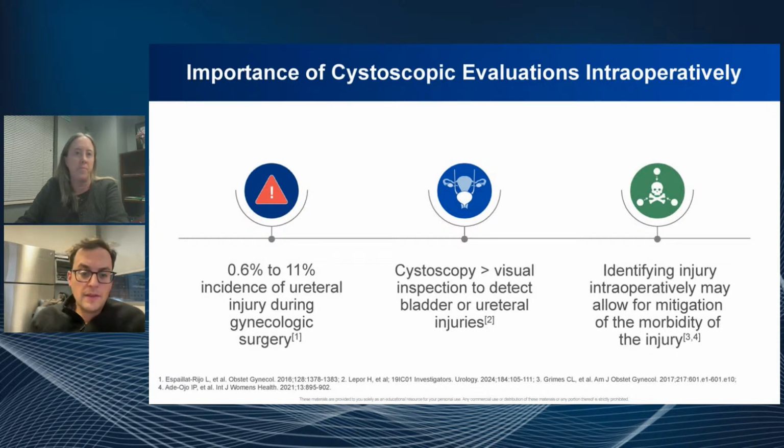Yeah, so Cara, thanks first of all, and I want to thank everyone that signed on tonight. Cystoscopy and looking for ureters is important for a lot of the surgeries that we do, and even general surgeons and colorectal surgeons do. In general, ureteral injury can happen. I think this is more of an anatomy thing than, hopefully, a surgeon thing.